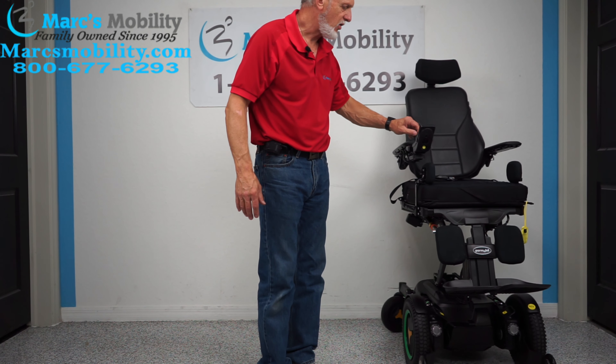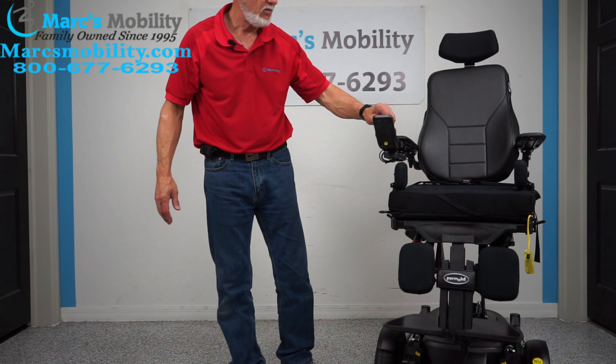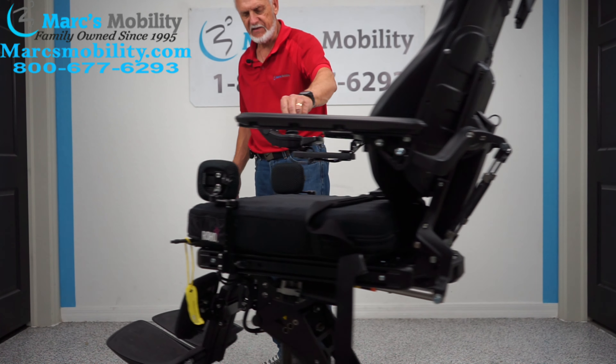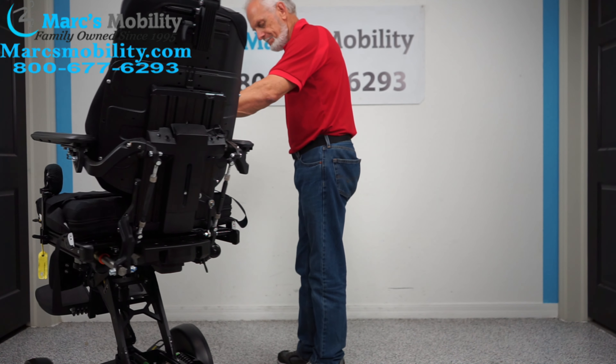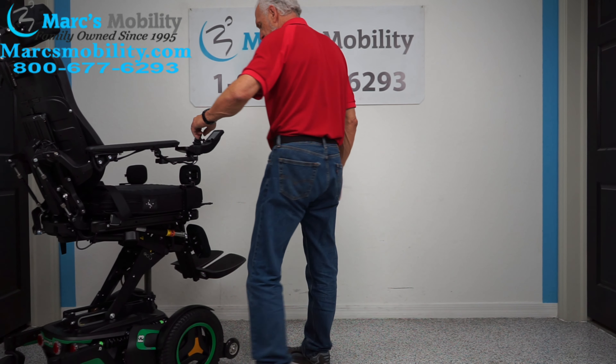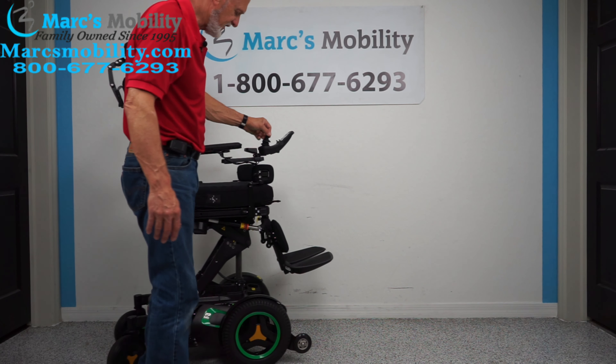This chair will drive at a really good speed with the seat elevated. You can still drive this chair at a decent speed with the seat elevated.